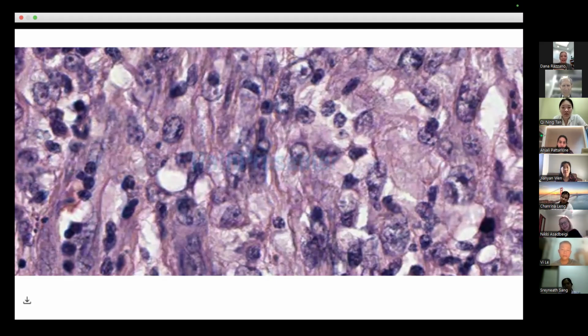Yeah, great. Thank you so much. Yeah, of course. And if you order it, it's better to order it red. I don't like anything brown for the skin for melanocytic lesions because it's a nuclear stain also. Oh, okay. That makes sense.